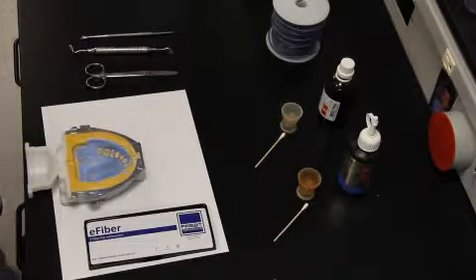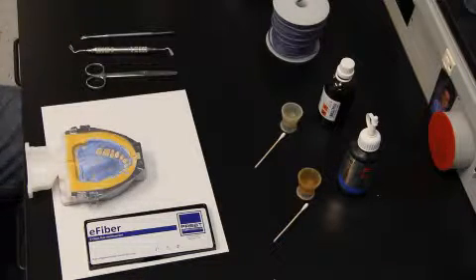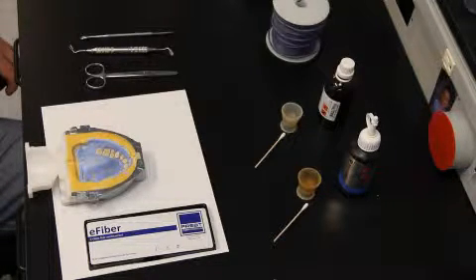Today we're going to be discussing the product E-Fiber. I use E-Fiber in my immediate load provisional cases. I'm going to show you guys how to put it together.